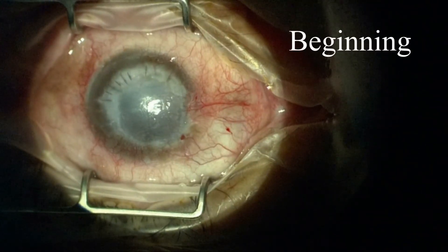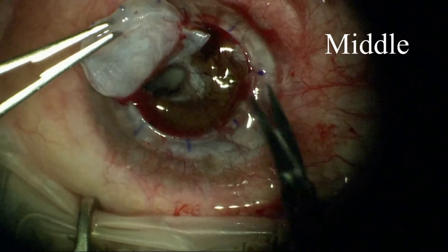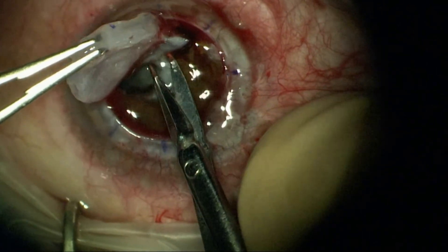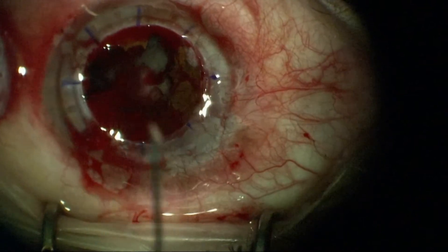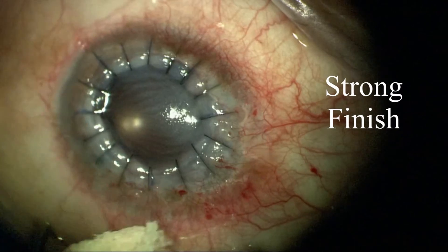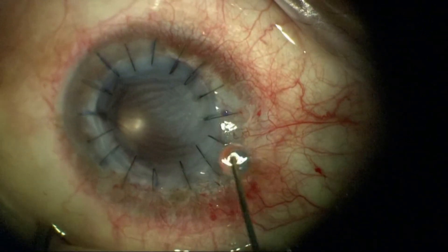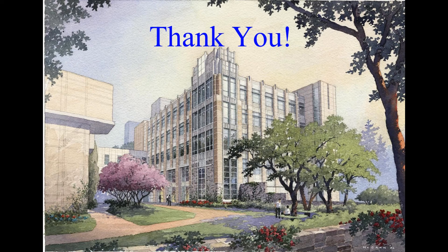Overall this has turned out well. To review: going back to where we were in the beginning, this looked like it had a fairly ominous prognosis, and then during the middle of the case there were several challenges with scarring, bleeding, and a cataract. In the end, I'd say we had a strong finish and a good beginning to 2014. Thank you.